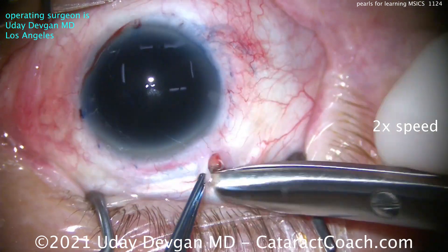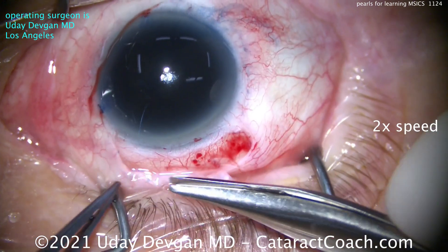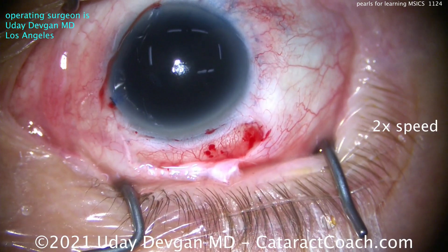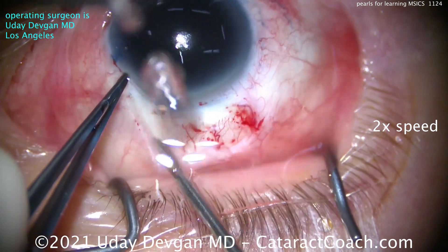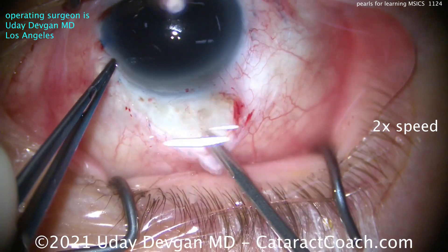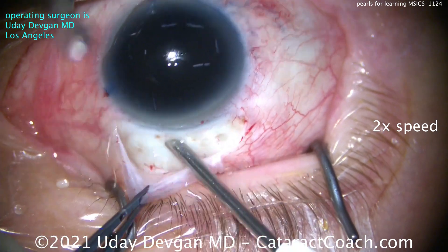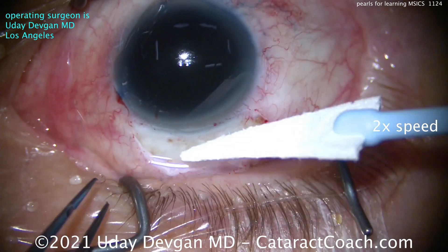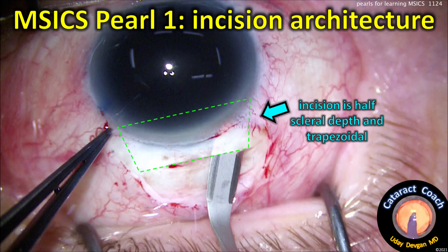The incision is very important. We're doing a superior peritomy. This patient has with-the-rule astigmatism of two and a quarter diopters, so this incision placement is going to help. With the peritomy done, a little bit of light cautery here to stop any bleeding and get a nice clear sclera. I also like to dry off the tissue and keep it pretty dry before making the main incision.